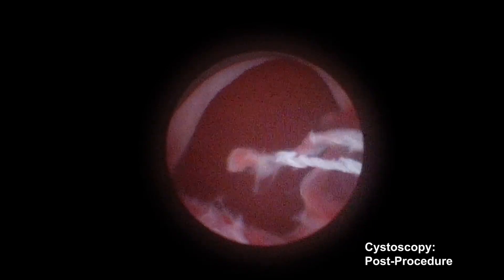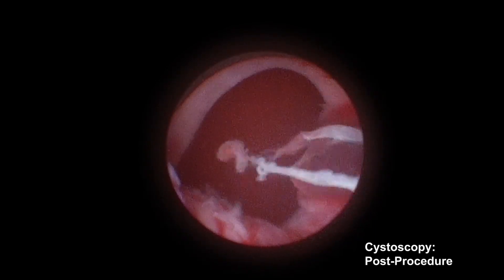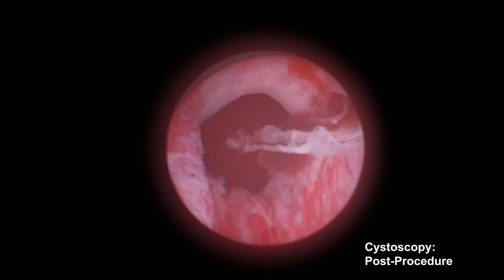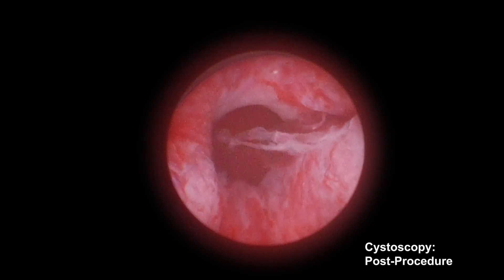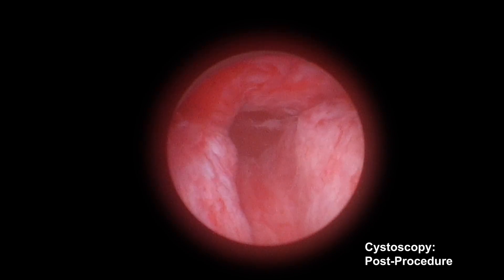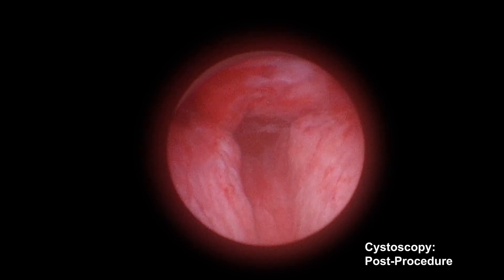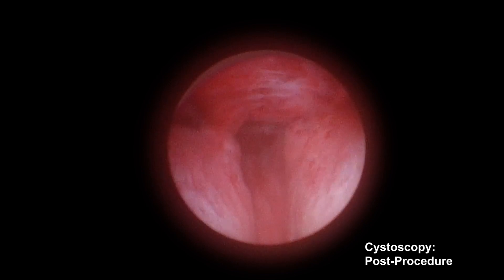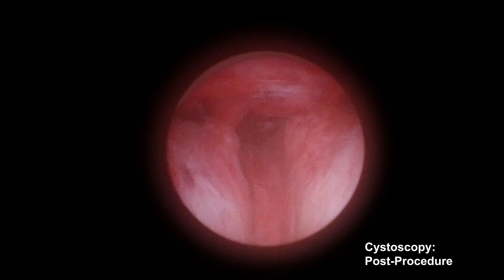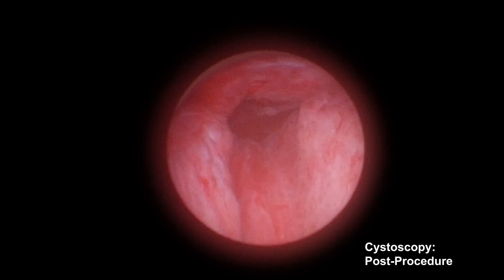I switch back to the UL2 with scope seal to survey the full prostatic urethra and placed implants. It shows a continuous anterior channel from verumontanum to bladder neck with minimal bleeding or mucosal disruption and complete resolution of the median lobe obstruction.